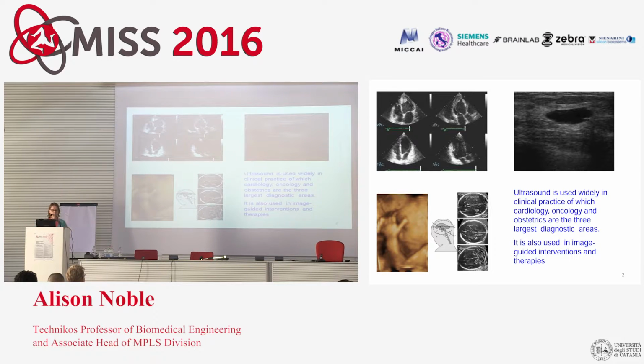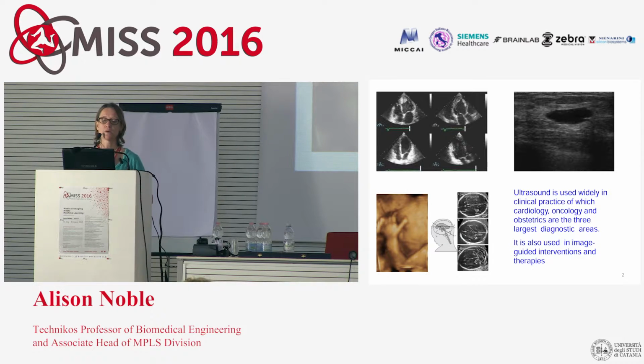The three examples up here, I'm not actually sure how well they are projecting. They're beautiful on my screen. They're not so beautiful from your perspective, I don't think. The three examples are the areas where ultrasound's used most widely. Ultrasound is the most widely used imaging modality in clinical practice. It's used a lot in screening, so the first point of call.